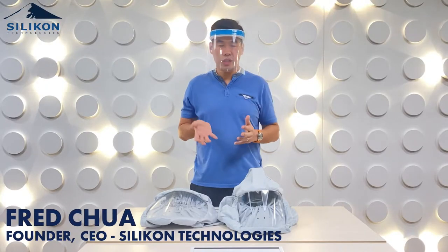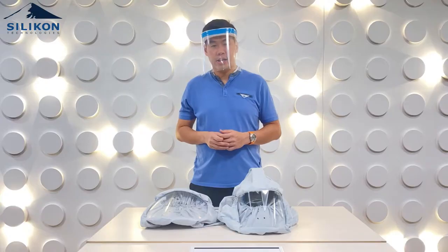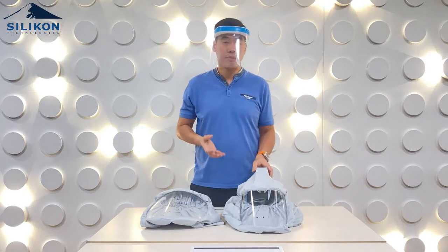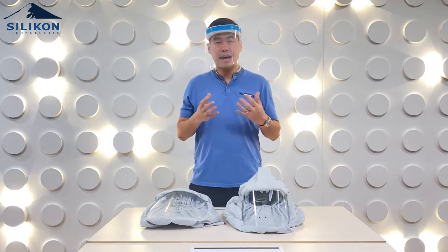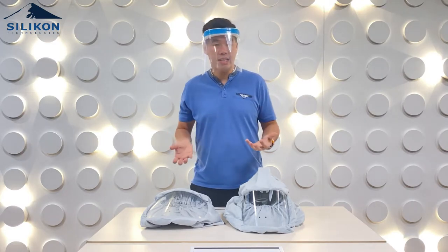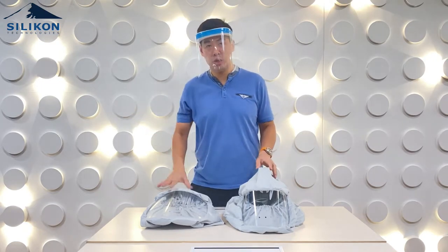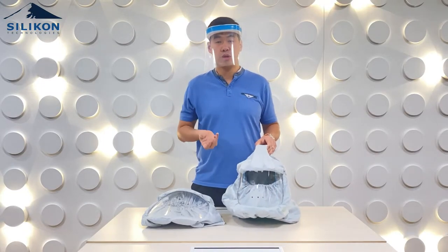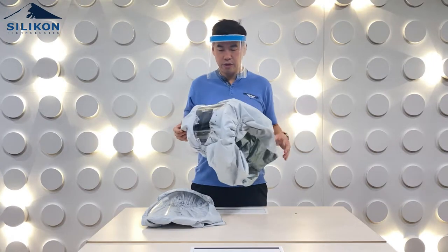Hello everyone. In this video I'd like to show you how to remove the hood from the hood frame. The hood can actually be detached from the hood frame, so in cases where doctors use their hood for highly infectious surgery cases, they can use it once and then dispose of the hood and replace it with a new one without having to replace the hood frame. It's a lot more cost effective.